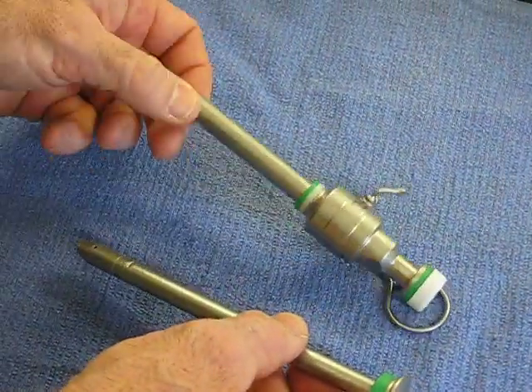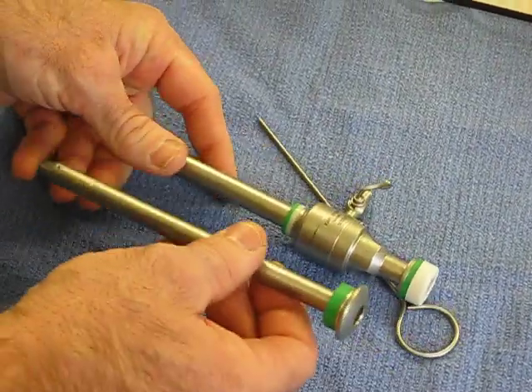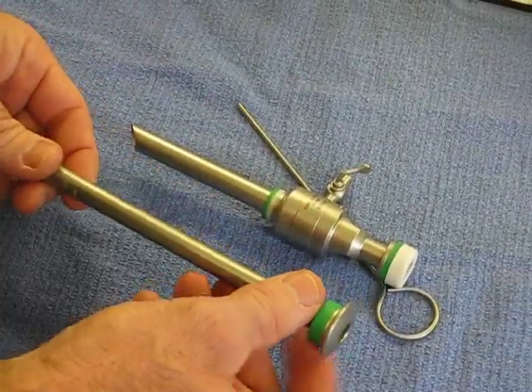This is how you clean the smooth wall cannulas with the automatic valves. You want to remove the trocar and clean that separately.